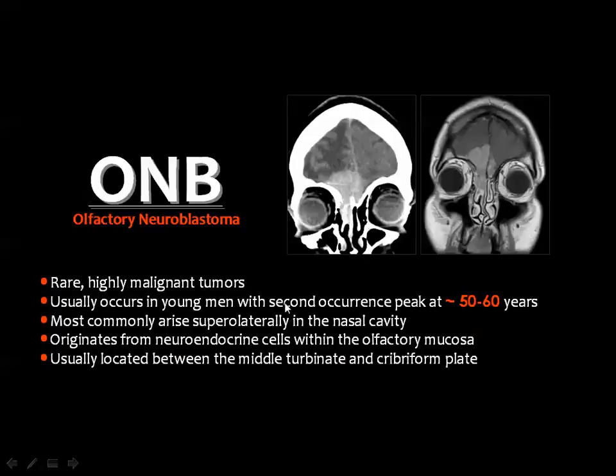This is a highly malignant lesion seen usually in young men, but there is another peak for this tumor at the age between 50 and 60 years. It's commonly seen in the superior lateral aspect of the nasal cavity, this area, and that's why it easily extends intracranial as well as intranasal.